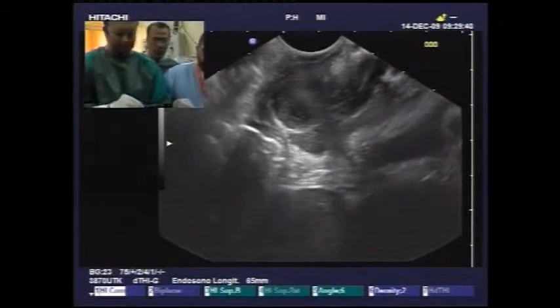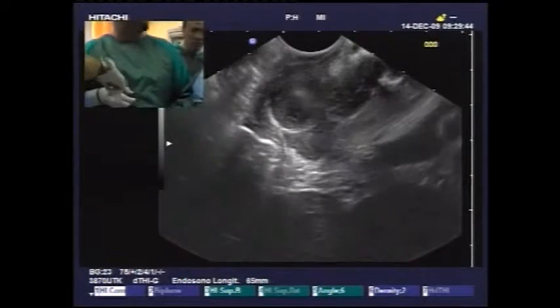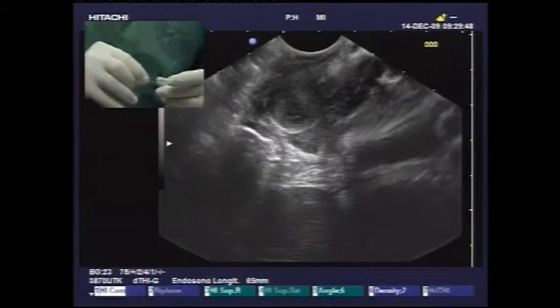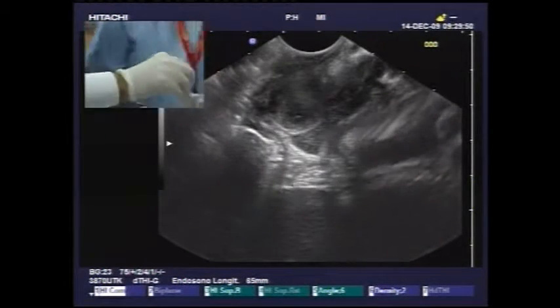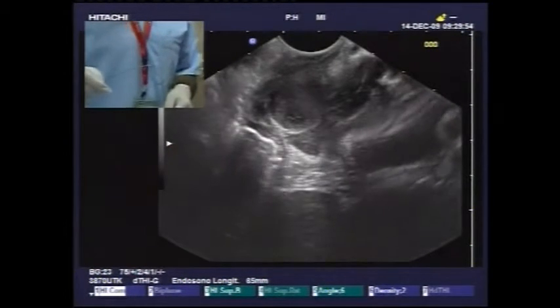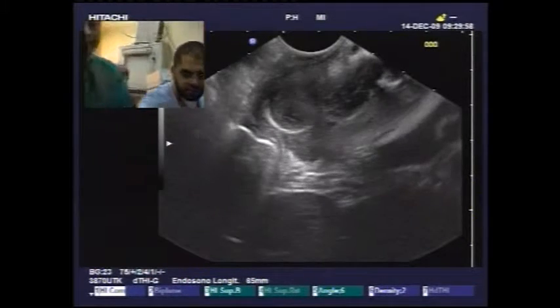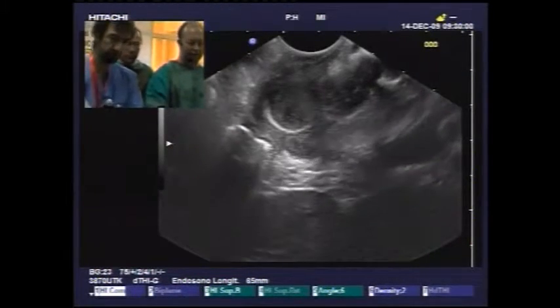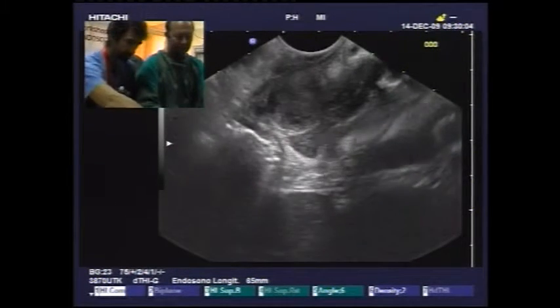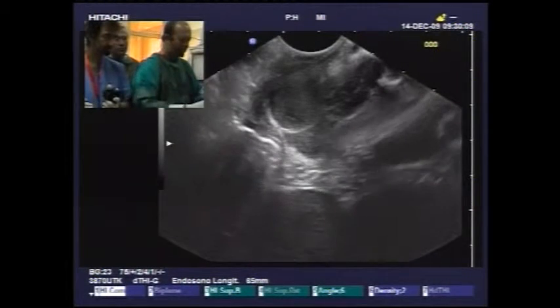It's pancreas. It's a cystic area. So we have managed to get inside the duct, and we are deep inside. We are injecting some contrast, and you'll see that it's a cystic space. If you are getting the fluoroscopy picture, you will see a very cystic area there. Dr. Kelgo is assisting me by twisting the scope in such a way that we have been able to get deep inside. And you can see the huge dilated area.